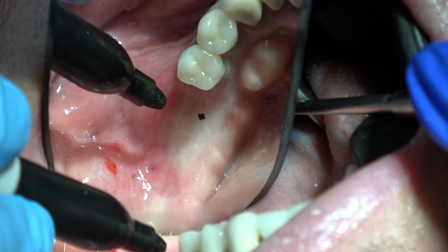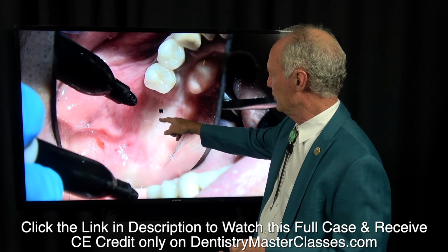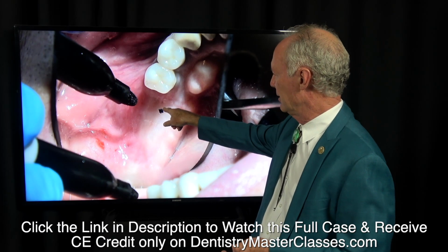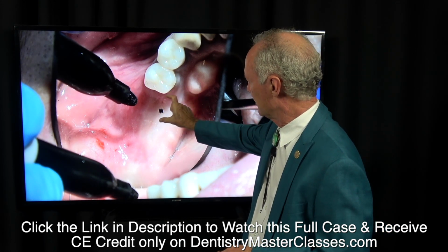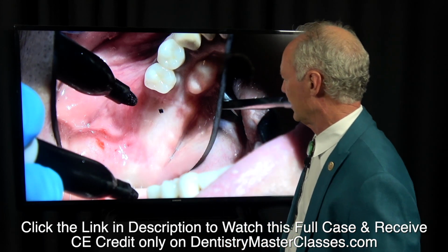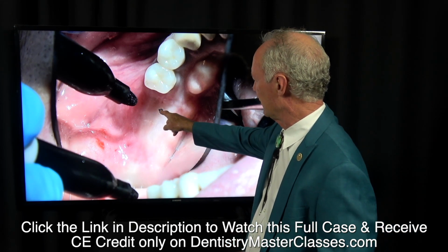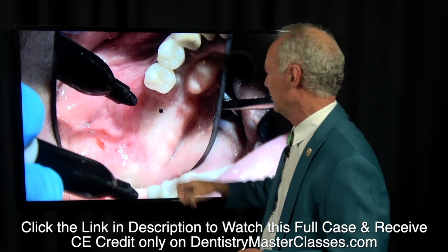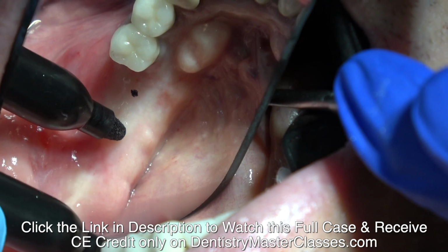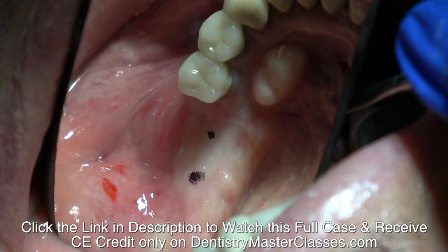So how far from this tooth would you ideally like the center of the implant? In a perfect world, you think how wide is a molar tooth? Probably 7-8 millimeters. So you'd like this in a perfect world about 4 millimeters from this tooth. This is a little bit further distally. Then I'm going to place a second implant there.